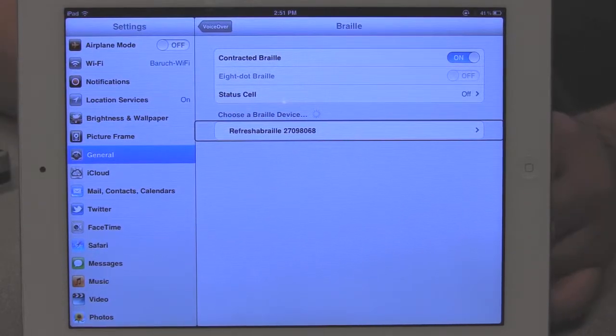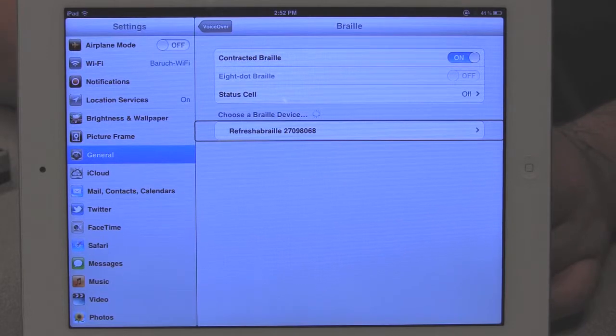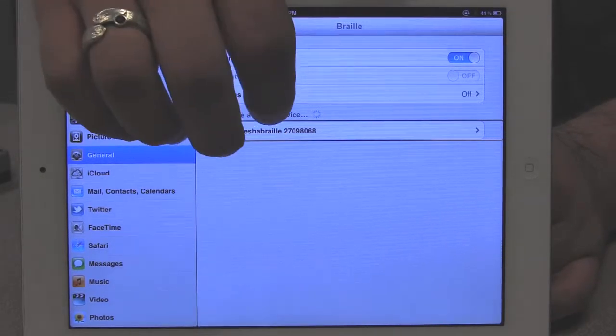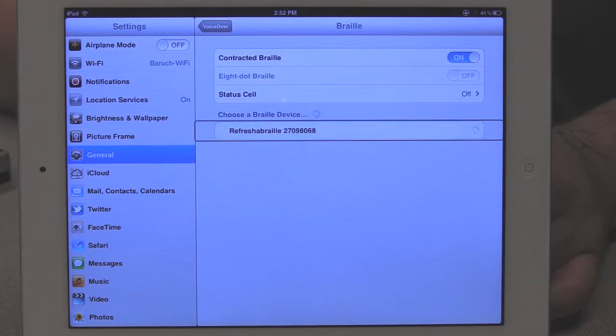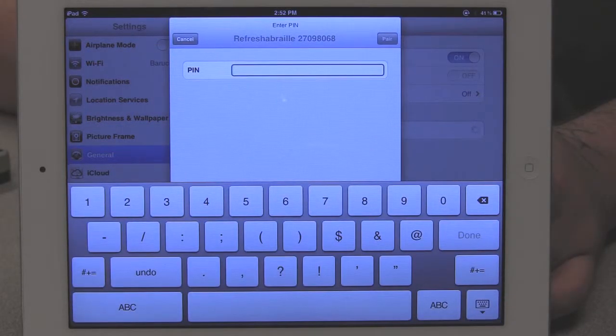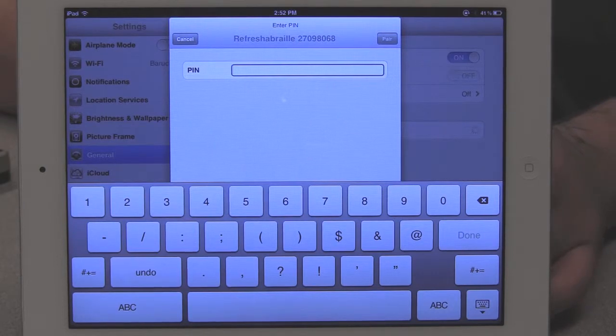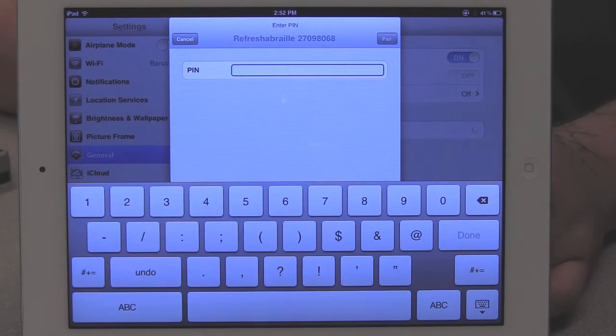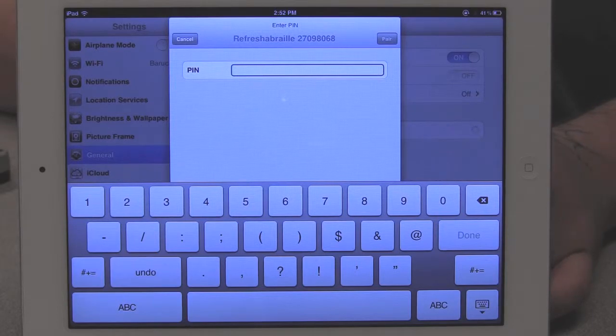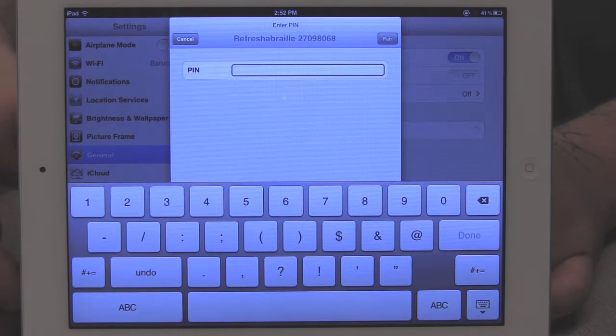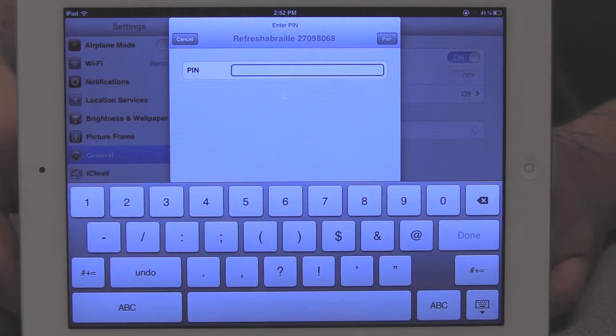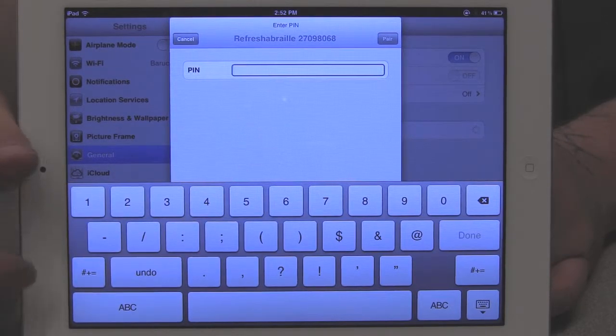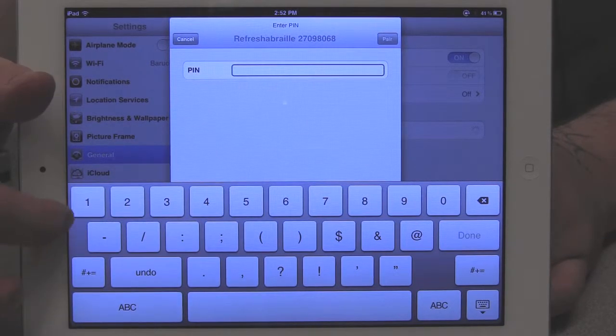The Refreshable Braille is the device that I'm going to be pairing the iPad with today, and I just double tap on it to start the pairing process. It asks me for a PIN here, and the PIN is provided to me by the manufacturer of the device. So each device has its own set PIN that will be provided to you. I'm going to start typing the number in.